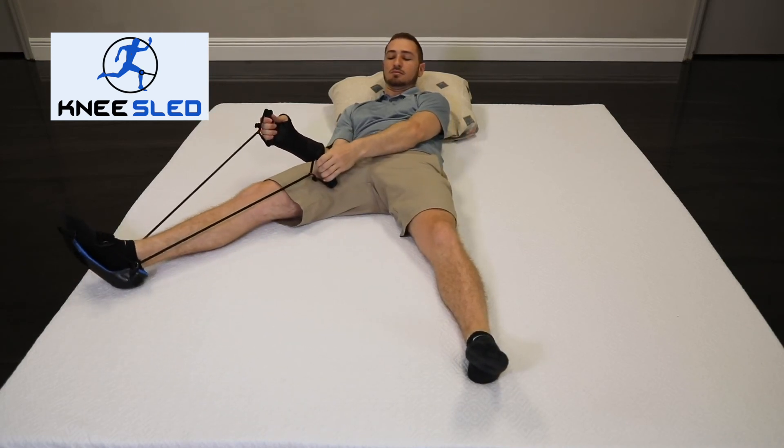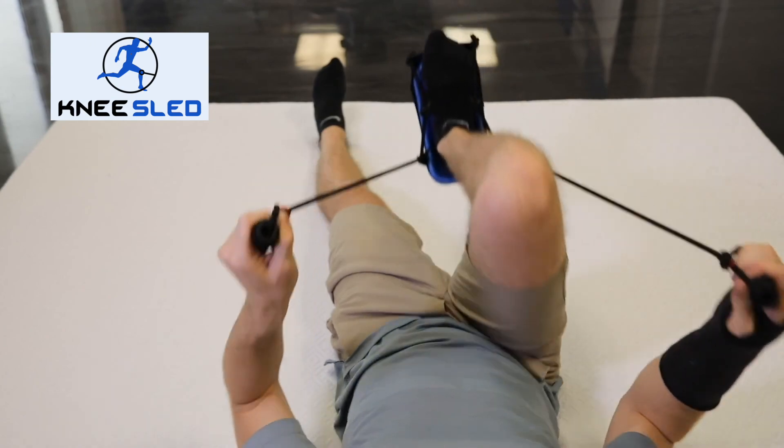You can exercise through a variety of planes. You can even simulate walking or riding a bicycle.